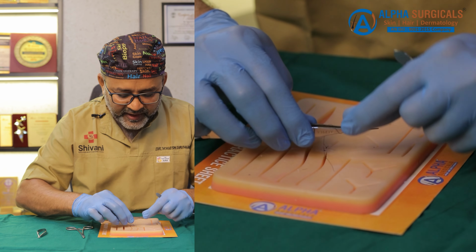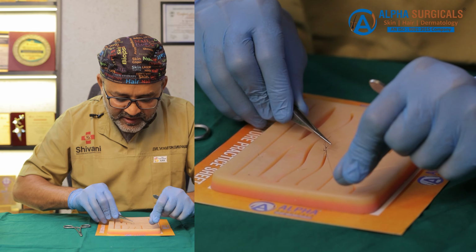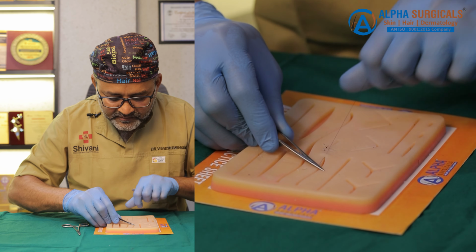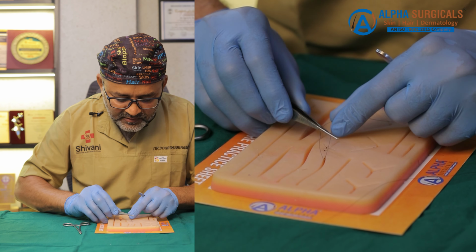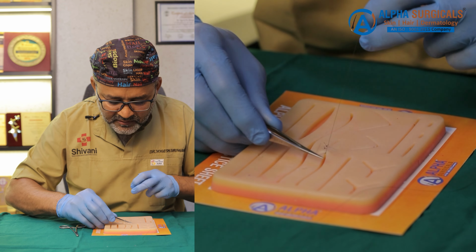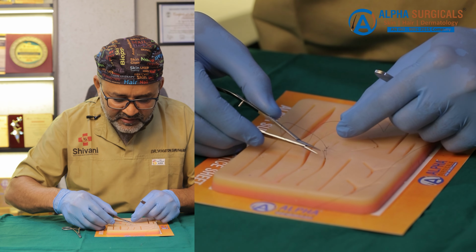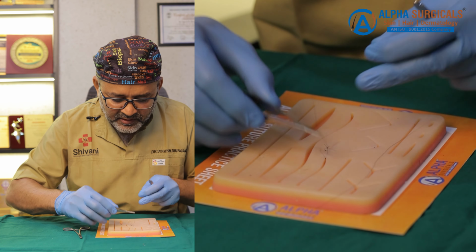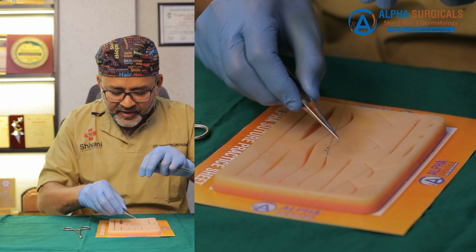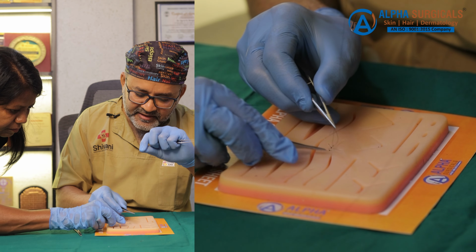Now taking the full length of the thread out and giving the closure. So 1, 2 and 3 loops are given, holding the second end of the suture material and pulling the thread to give the closure. Then second knot, then third knot and fourth knot. So while we cut the thread, we have to look for, we are cutting from the last knot itself.